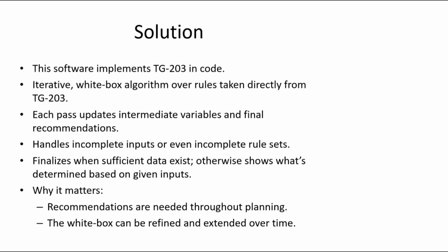The reason that's important is because what you effectively need to do when providing these consults is to make recommendations at different points of the planning process. So at an earlier point in the planning process, you may need to make recommendations based on incomplete inputs. And then as the planning process proceeds, you have more inputs and can make further recommendations. Also, it's important because this white box can be refined and extended over time because it doesn't require you to have a complete rule set from the get-go.